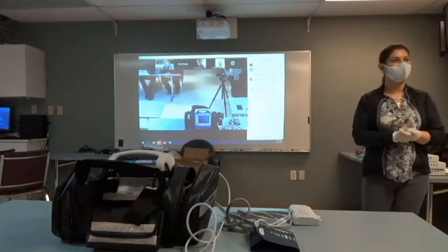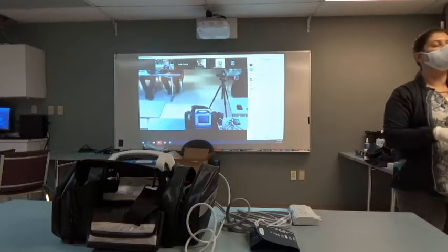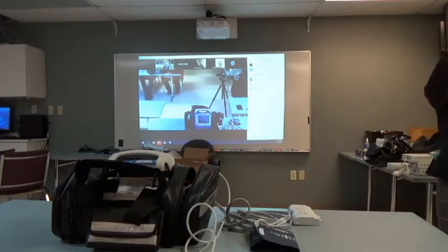Any questions about that? If for some reason you needed to switch to a new case inside that 2 minutes and you turn it off and turn it back on, is there a way to do that? Yes, there is. You can physically close the case out and begin a new one. Okay. There's a button push.